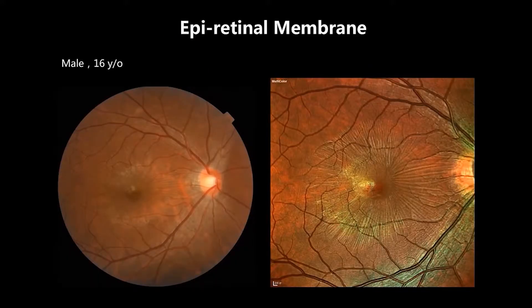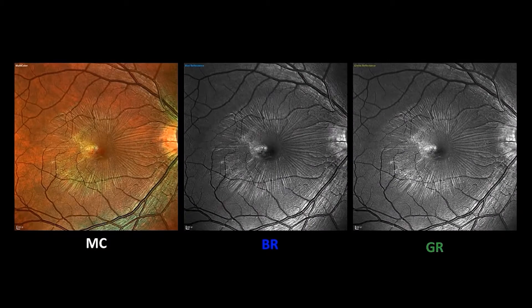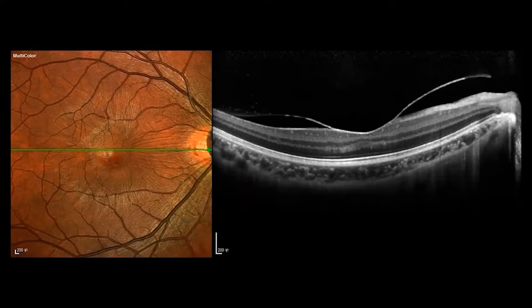The first case is epiretinal membrane. On the multicolor image, we can appreciate the structural changes of the epiretinal membrane. The epiretinal membrane also stands out on blue and green reflectance. Combining with OCT, the epiretinal membrane is shown clearly. Multicolor imaging demonstrates better structural changes than color fundus photo on epiretinal membrane.